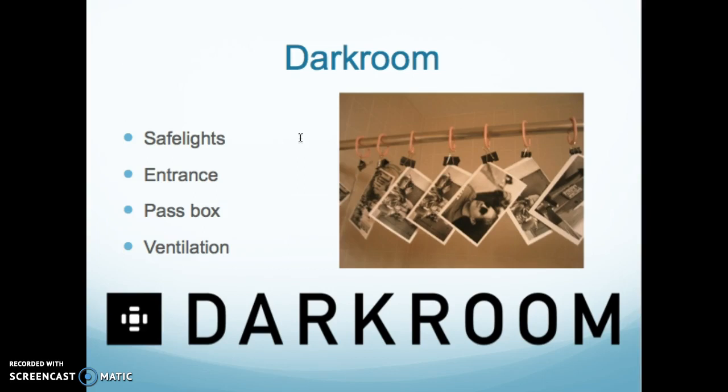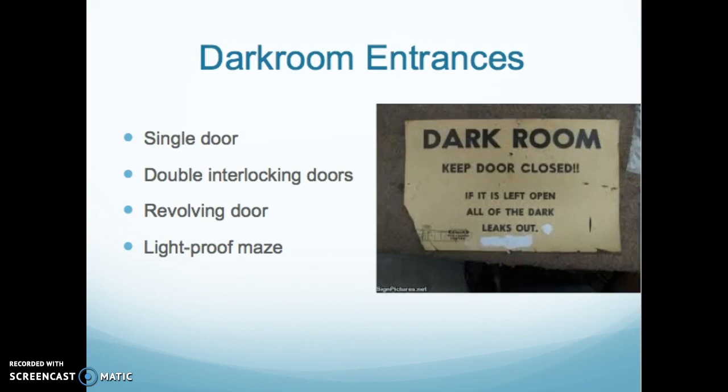You hear some old radiologists call it a wet room, and that's because we used to hand dip the films and hang them to dry. If you hear the word wet reading, this is where it came from. They used to hang the films up, and the radiologist would come in and read it while it was still wet, while the film was drying.